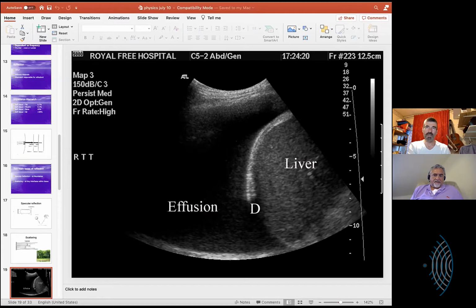Now in musculoskeletal, you see this in the muscle. You see it in the texture of the fat. But it's less important. But this is essentially what you're looking for when you turn up that volume, when you turn up the gain, when you're making sure something's a cyst. Because you don't get this in a cyst, this slightly mottled, irregular pattern.